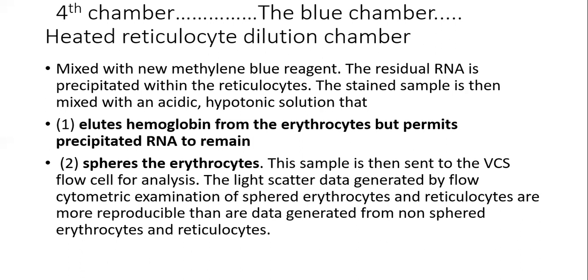It is up to us whether we take the staining part, or the lysing and staining reagents, from the company. Usually it is a very costly affair. Somehow the cost of this stain is very high, and most hospitals don't prefer this method. But if this is a good institute, you can have an automated reticulocyte count.